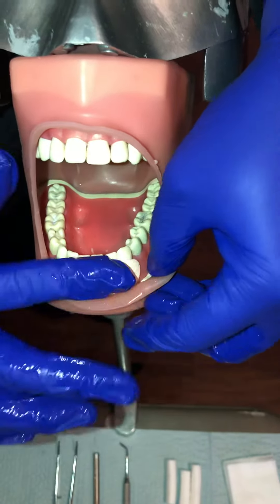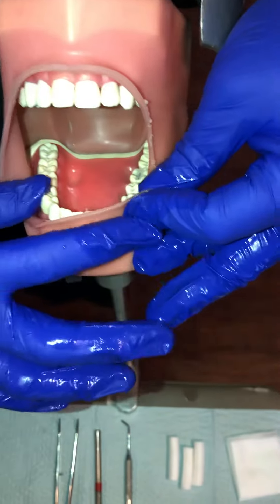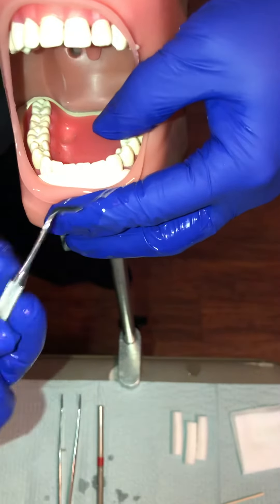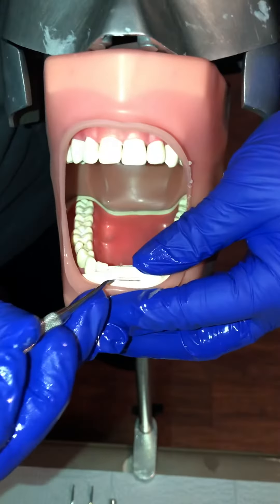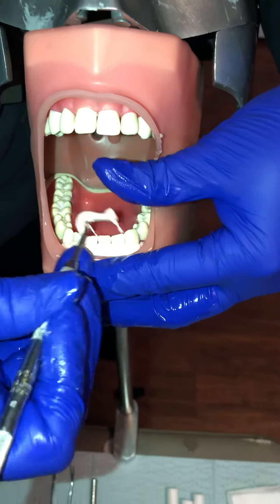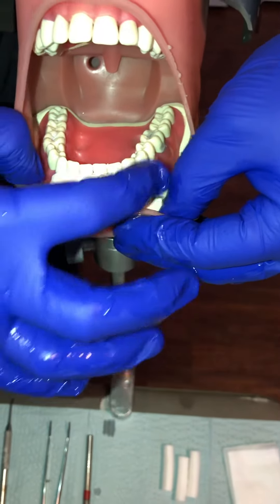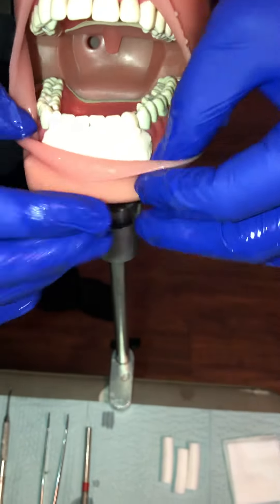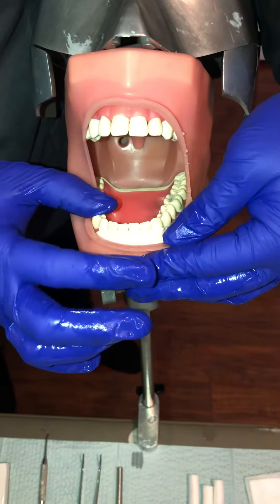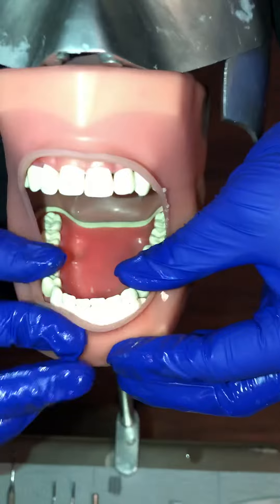You can do almost all of this without any instruments. Take the lip and kind of mold it around. If it comes up too high, just take a scaler and come across about two-thirds of the way up and trim that excess away, then smooth it out. You don't want it to interfere when the patient bites together. The doctor would have them come back in either three days to about two weeks, depending on the surgery, the doctor, and the healing time.